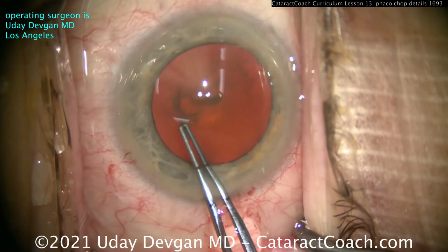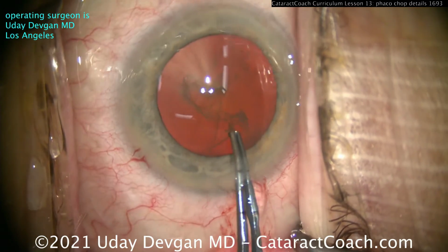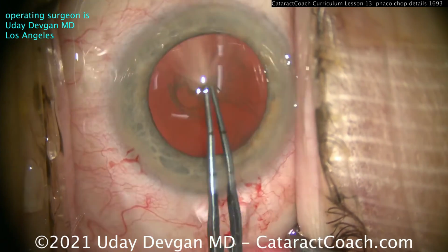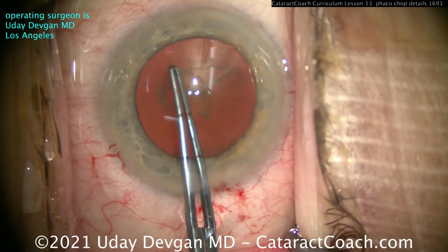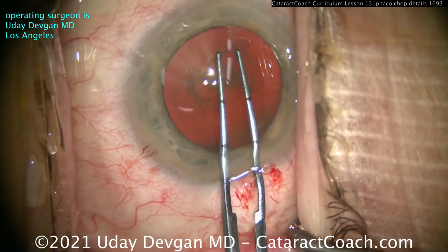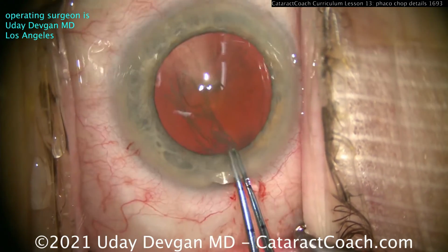Now, with a denser lens, don't make a baby rhexis. Do not make a 4mm rhexis. You know you like to do that sometimes because you get afraid. But have the courage, have the faith, make that 5, or even better, 5.5mm capsular rhexis. That's going to make it a lot easier to get these denser nuclear pieces out of the capsular bag.